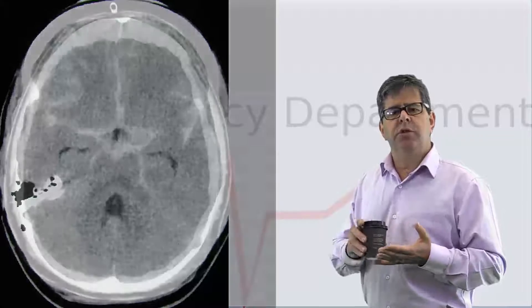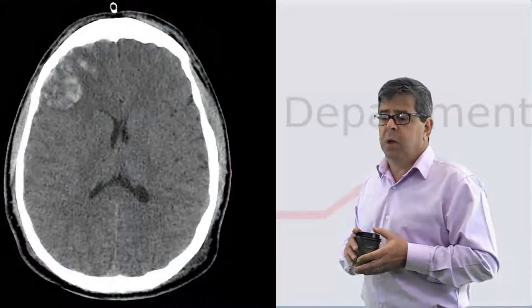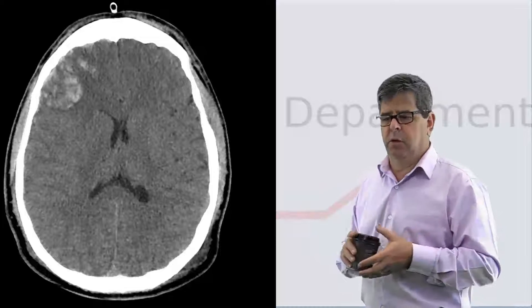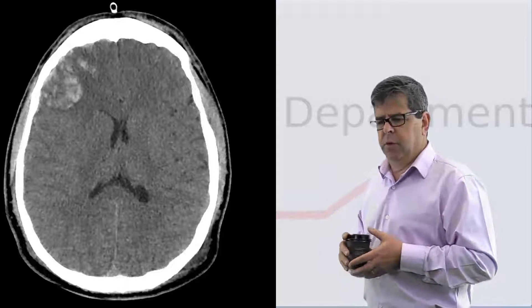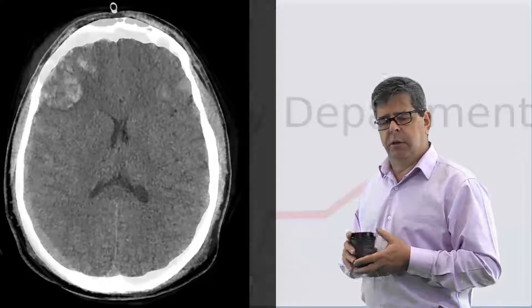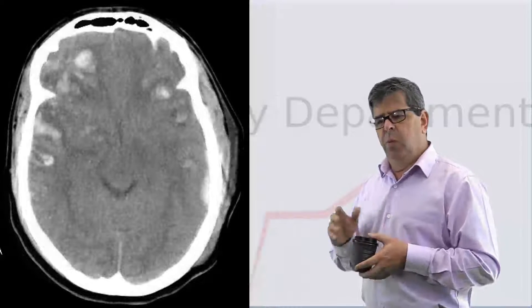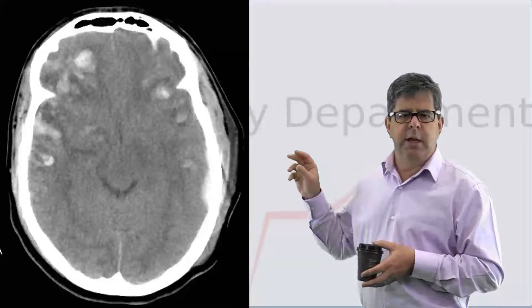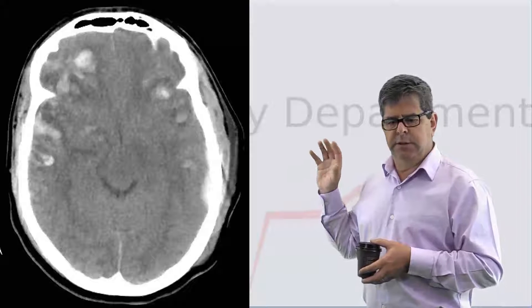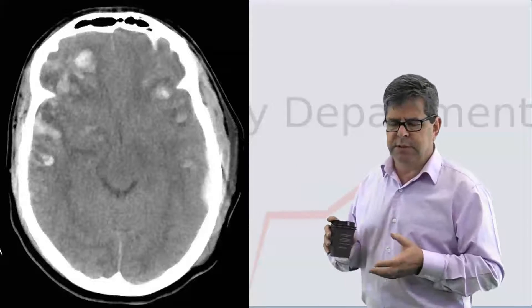What about contusions — bruising inside the cerebrum? They could occur anywhere: from a direct strike, a contre-coup injury, or deceleration. What you see are small white areas inside the cerebral tissue, which are relatively easy to see.